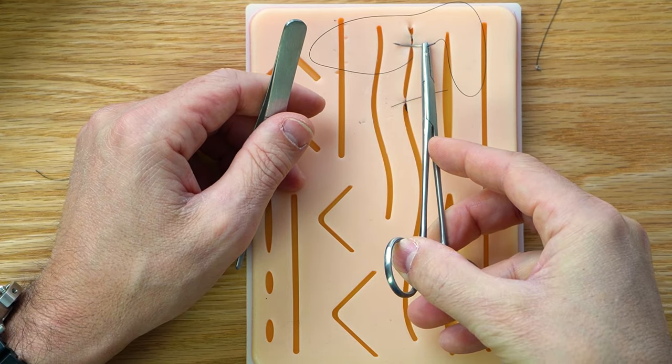And for some tissue that works better, it just depends on the person's tissue really. Sometimes you need to go totally parallel and sometimes it's really lax, depending on the part of the body that you're doing this, and a little bit of angle is actually better. See, that comes together pretty good there. I'll do one more here. And this is all in the dermis. So all of these you want to be very close to the same depth, okay? And then you have a couple options when you finish.